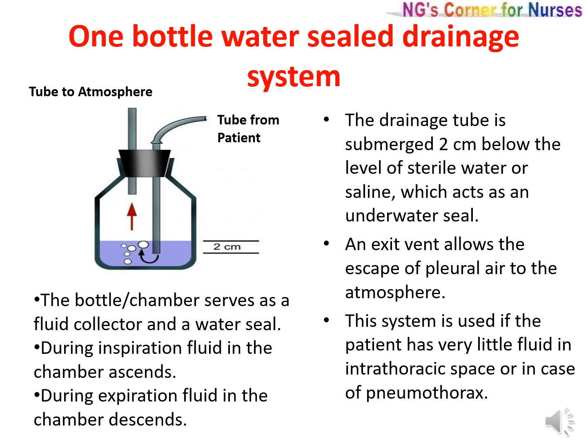In this picture we can see there is a tube from patient and an exit vent, that is the tube to atmosphere, and the drainage tube is submerged 2 cm below the level of the water.